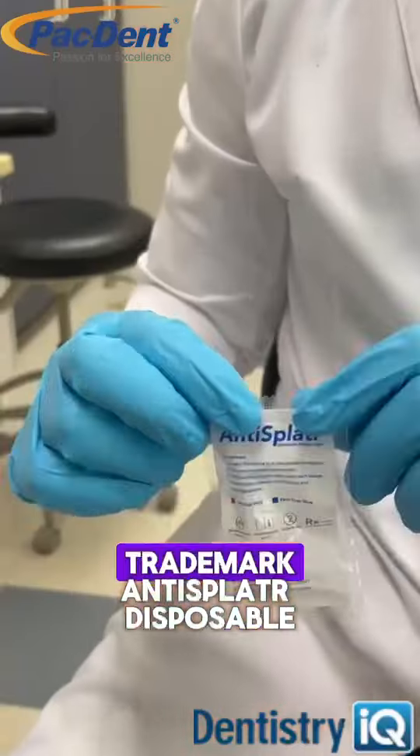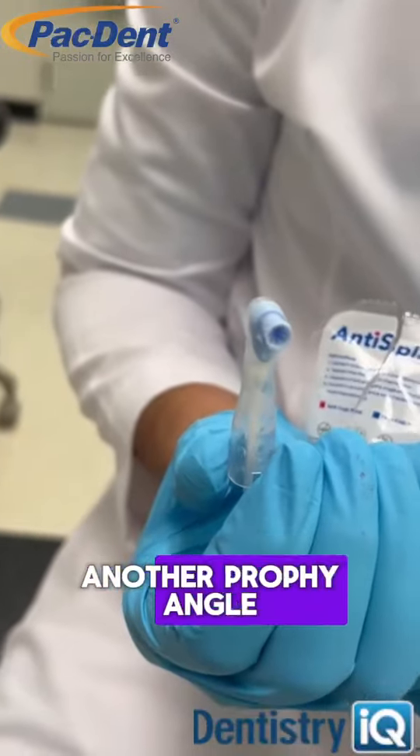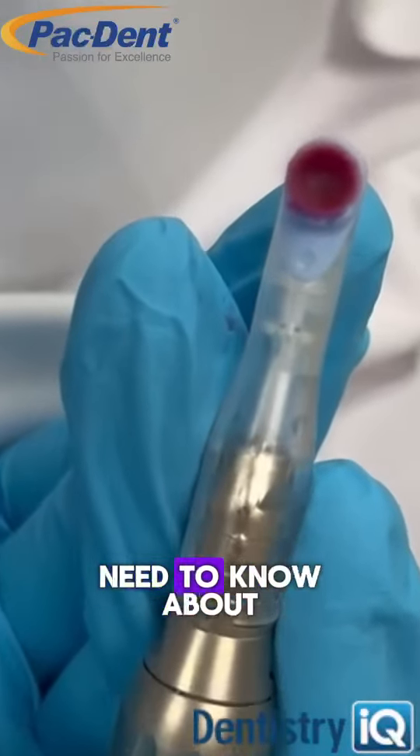Now add in Pac-Dent's trademarked AntiSplatr disposable prophy angle. This is not just another prophy angle. In fact, there are three components to its technology you need to know about.